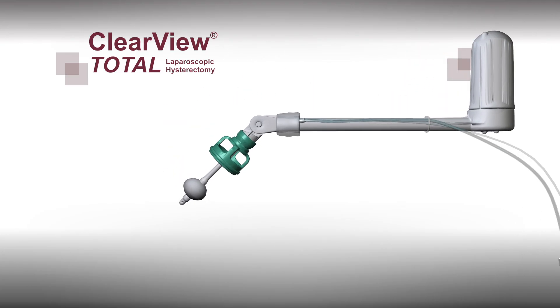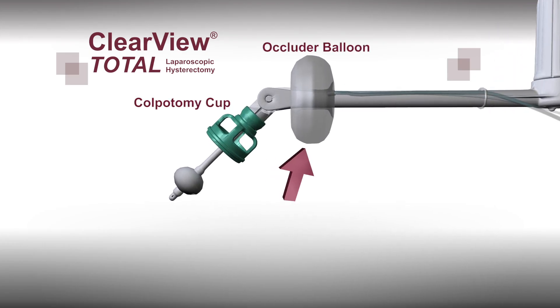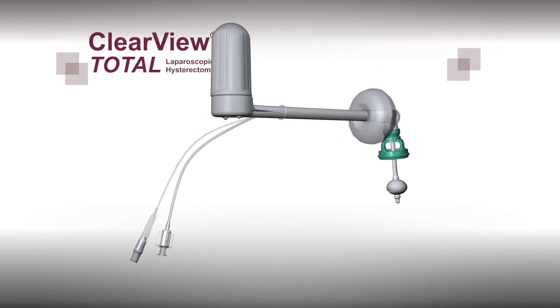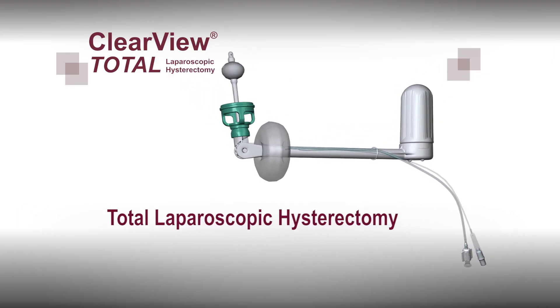In addition, Clearview Total includes three different sizes of colpotomy cups and an occluder balloon. Clearview Total is designed for use in laparoscopic procedures where it is desirable to delineate the vaginal fornices, specifically total laparoscopic hysterectomies.